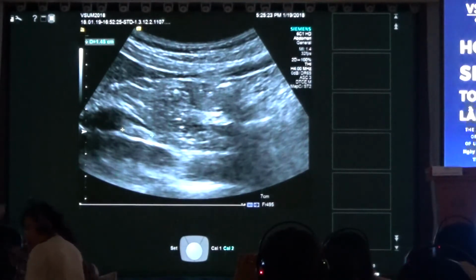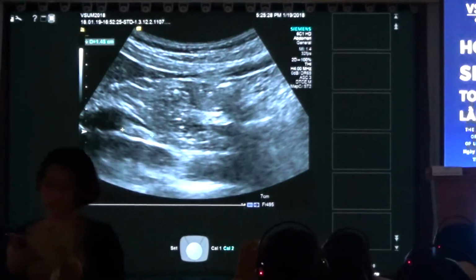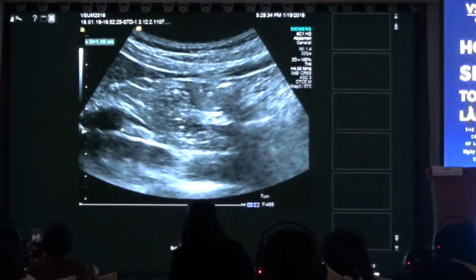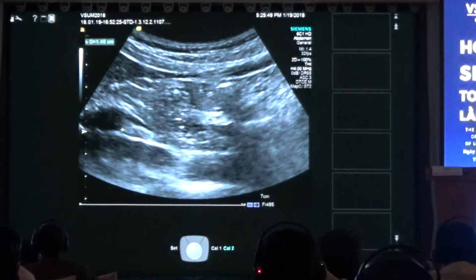In patients with hepatitis, autoimmune hepatitis, virus hepatitis, those lymph nodes are always enlarged. And you can see them quite nicely using B-mode ultrasound. So this is also in this position of the paper. At least he has an exclusion of about 90% that he has no virus hepatitis or inflammatory liver disease.